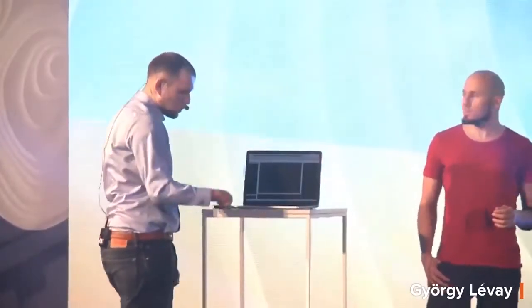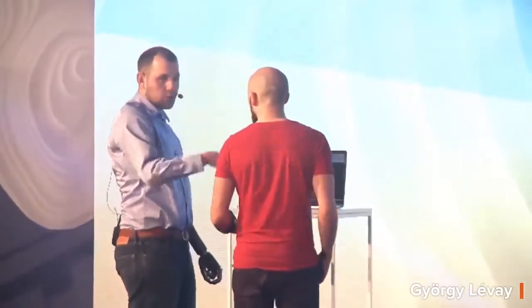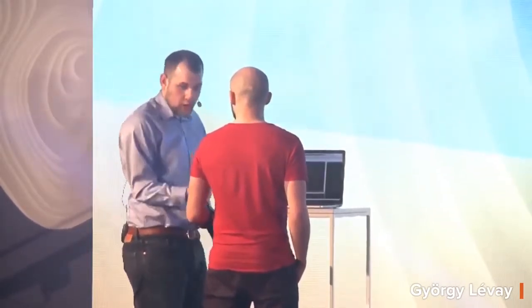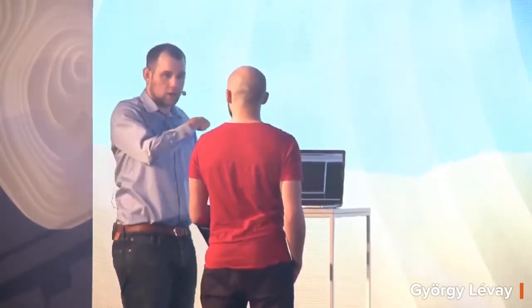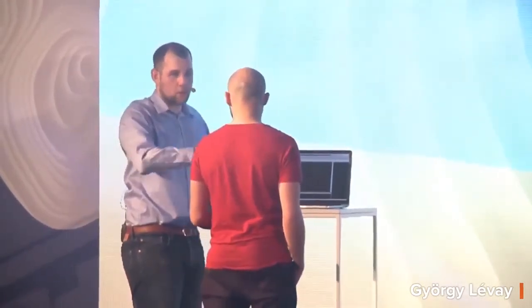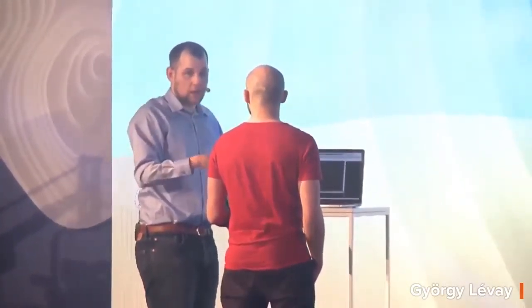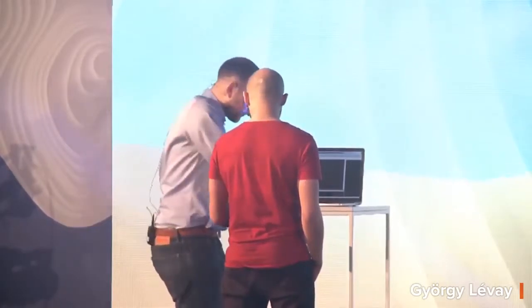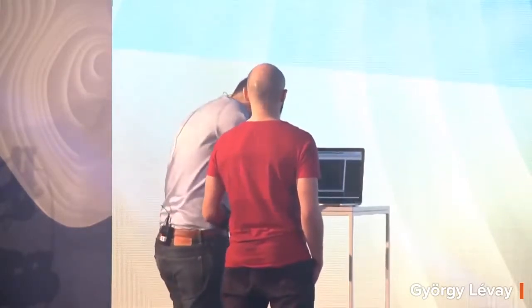So I'm going to ask you to come here, right here, and you're going to see images of the movements that we just did. And anytime you see an image, you do that image. And make sure your hand always stays in this position. And try very hard to make sure that when an image is done, you rest. So, for instance, if you're doing a palm down, which is rotating your hand down, if a close comes after that, you don't go to close immediately. You go back to normal, and then you do a close. Okay? What's the default? This or this? Whichever you want to be the default. Okay. So that part is up to you.